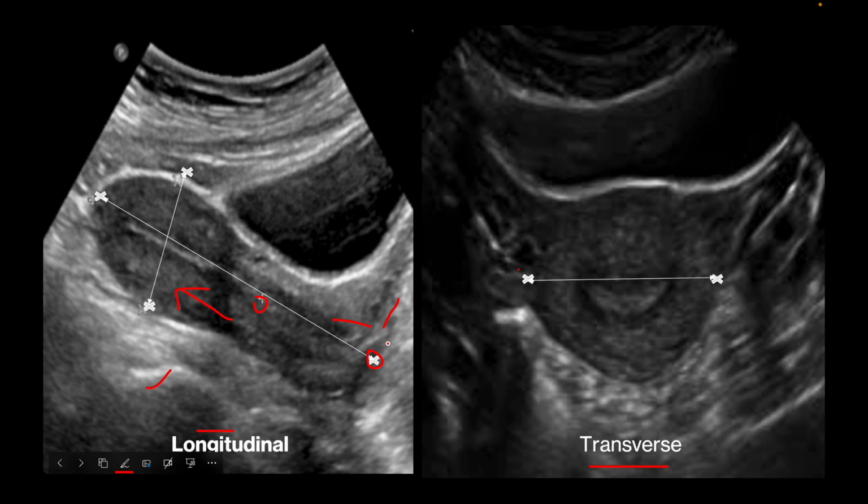It may be difficult to separate the uterine body from the cervix in ultrasound. However, if you compare the myometrial echotexture, myometrium around the cervix is usually denser and more homogeneous, but the myometrium around the uterine body is usually heterogeneous. Endometrial strip in the uterine body appears as a bright hyperechoic line that runs through the center of the uterus. On the other hand, cervix usually lacks this central line, which may help to differentiate between uterine body and cervix.